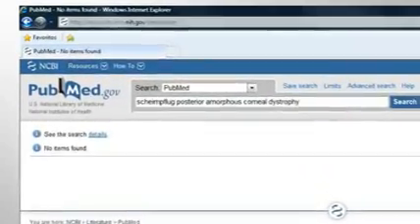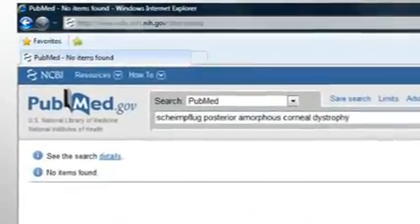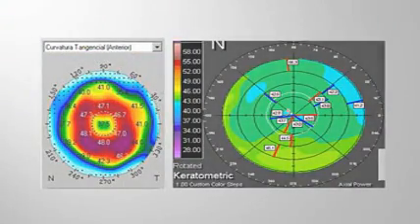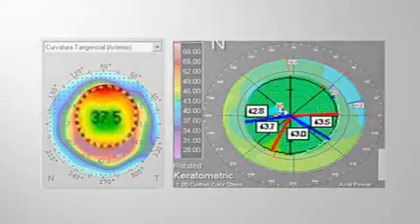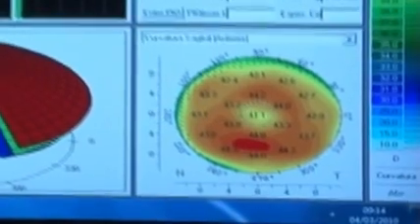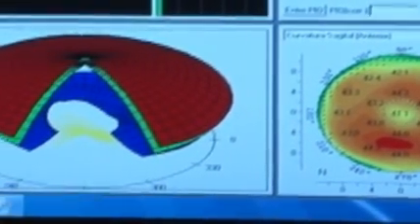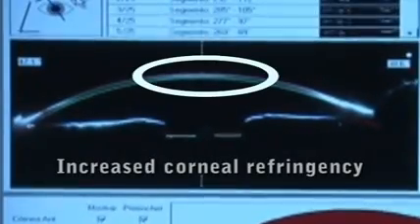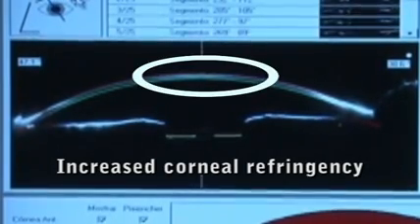To our knowledge, this is the first documented case in the literature describing a central corneal curvature misreading by the Scheimpflug system with Pentacam in a patient with PACD. In this case, keratometric measurements obtained from the Scheimpflug system led to postoperative refractive surprise, as the measured central corneal power was flatter than it actually was. We theorized that the abnormal corneal transparency may have disrupted the Scheimpflug system from functioning properly, inducing an artifactual central corneal planation and, as a result, leading to inaccurate IOL selection in these patients.